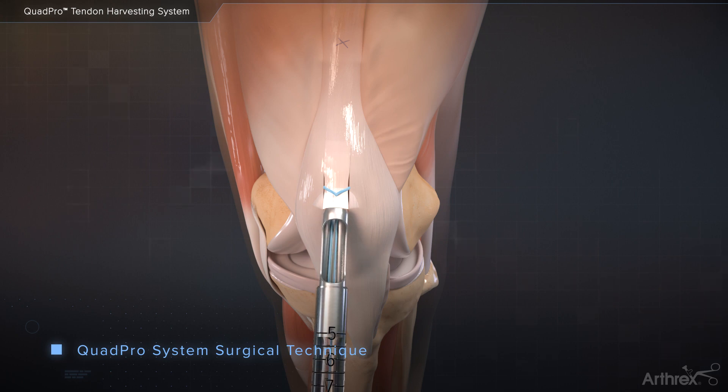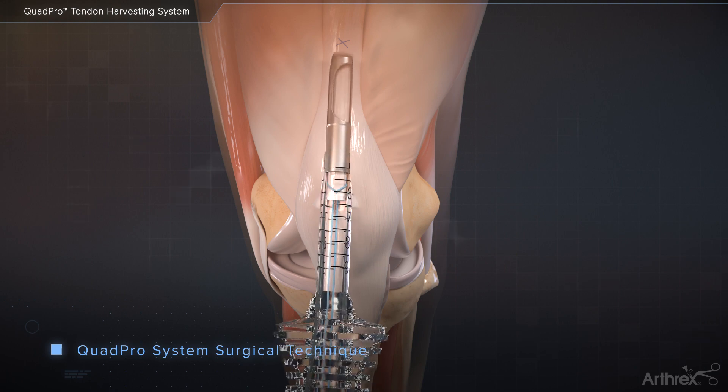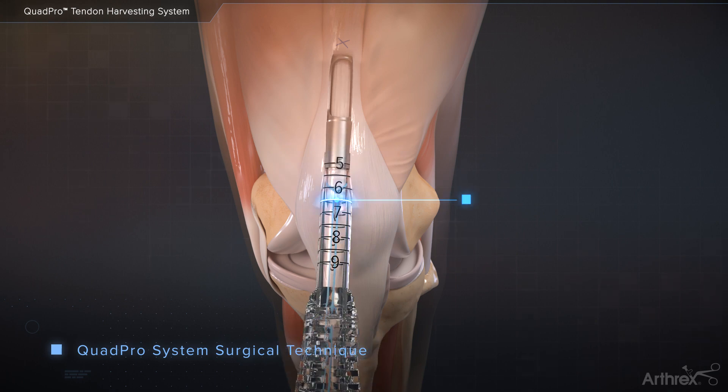Advance the tendon into the tip of the harvester, ensuring the suture is not cut by the harvester tip. Keep steady tension on the suture and begin rotating the harvester while advancing up the tendon, directing the harvester toward the proximal mark on the skin.